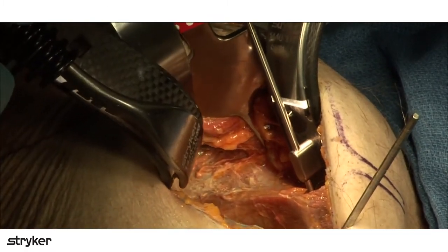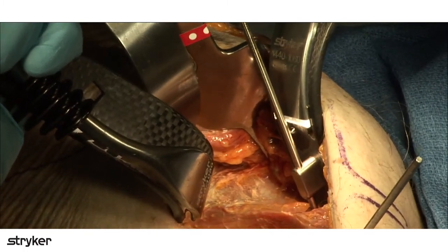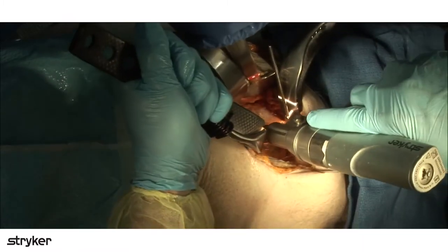All right, and I think what's happening is you're rotating the patient. All right, so I might block your view for a second here, but I'm just going to put this other stabilizing K-wire in.